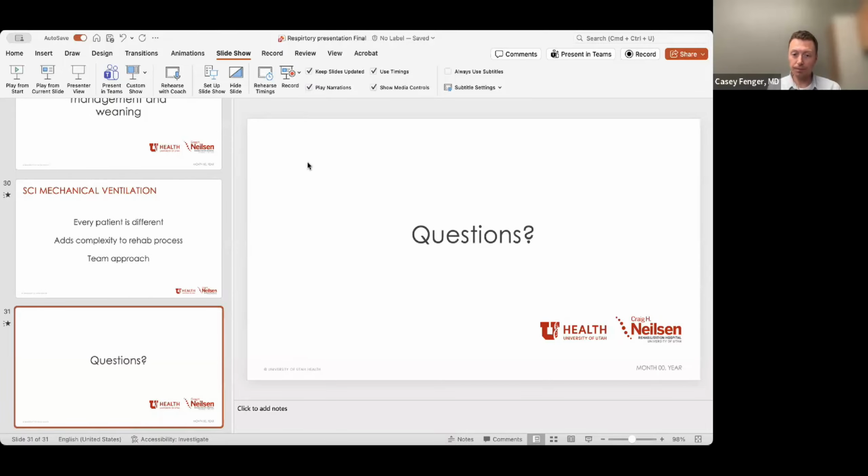One way you can check on inpatient rehab is just how much tidal volume are they able to pull with minimal pressure support, right? You can easily just turn the ventilator off or turn the pressure support down to zero and ask the patient to take a deep breath and see how much they're able to pull. Again, that's not perfect early on, but as time goes on, that can cue you in.